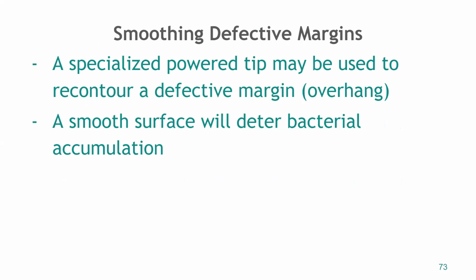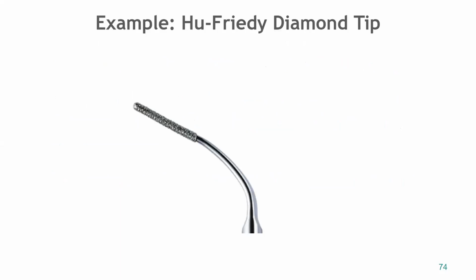There are specialized powered tips that you can use to recontour a defective margin or an overhang. And that smooth surface is going to be easier for the patient to clean and deter bacterial accumulation. So this is an example of that, the Hu-Friedy diamond tip.